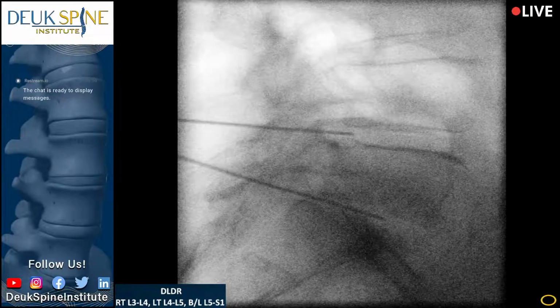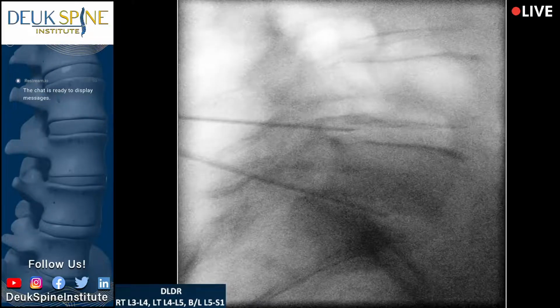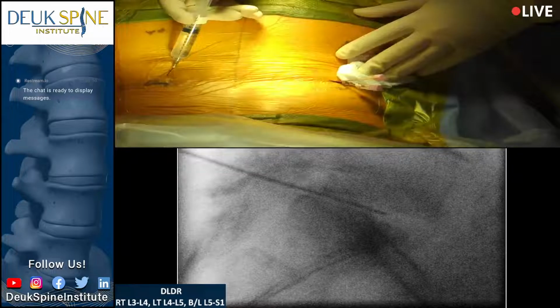Shot? Where does that bother you? In your back. Shot? You okay? All right. 2 down, 2 more to go. Okay? So we're going to be putting her to sleep soon, but not yet. I need her awake to make sure we don't get too close to any of those nerves we talked about. Going to give her a little more numbing medicine. Yeah, you're fine. You're doing great, by the way. Hang in there. Little numbing shot.